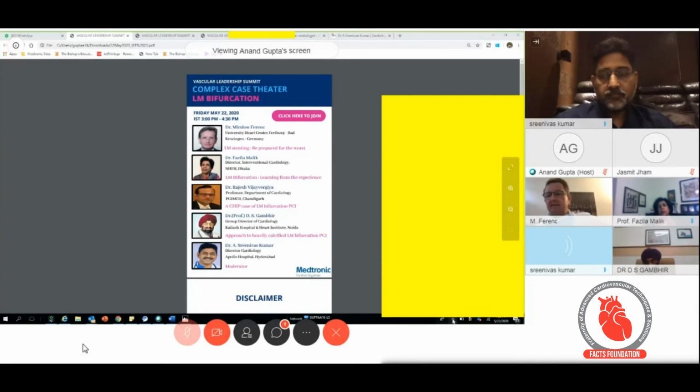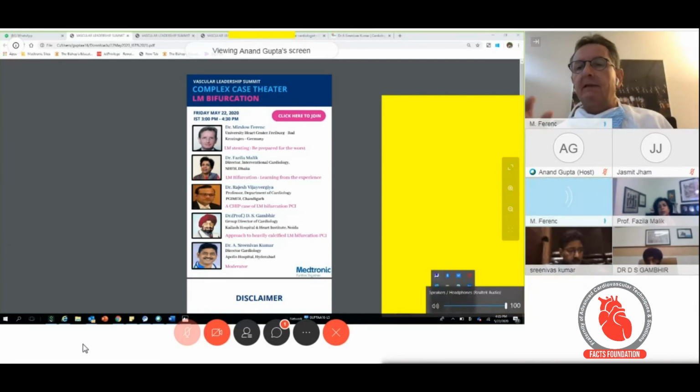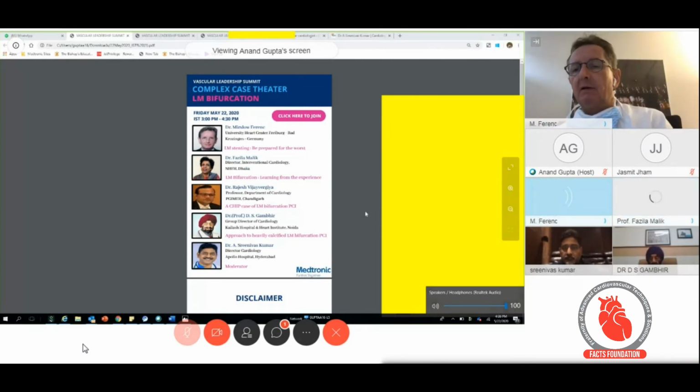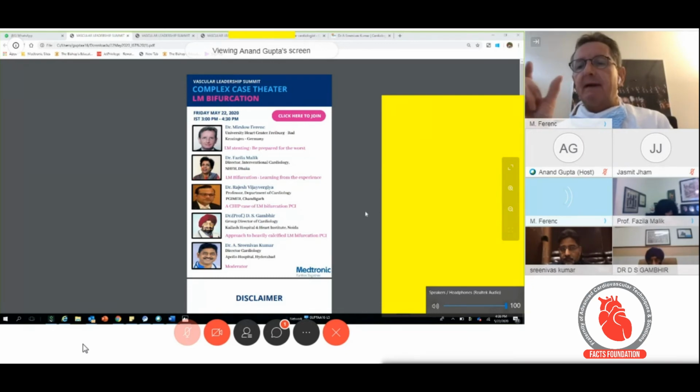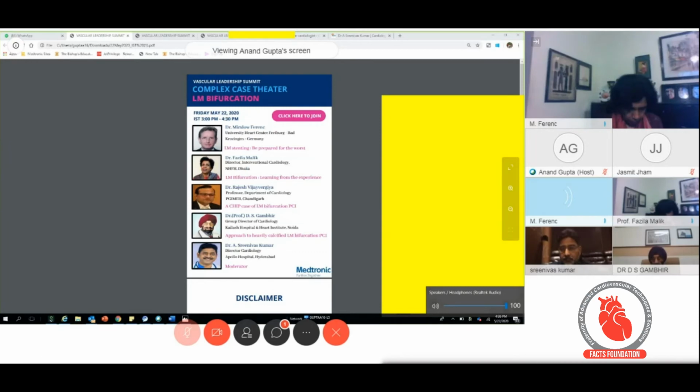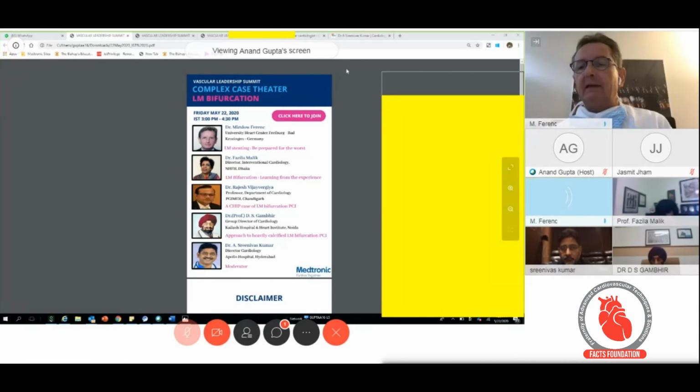Yes, the very clear message to everybody: if you have a distal left main bifurcation and your proximal part of the left main is healthy, and your left main is long enough, then you could just go from the lesion. Maybe you go from the healthy part of the distal left main and perform distal left main management. That's okay. You don't have to stent the complete left main. If you have a short left main with a distal left main stenosis, then I would definitely recommend not to leave 2-3 millimeters area without stenting. Then you just go from the ostium to the LAD or circumflex with the first stent, whatever. And do not forget to perform optimal post-dilatation with non-compliant balloons. This is, I think, very, very important.